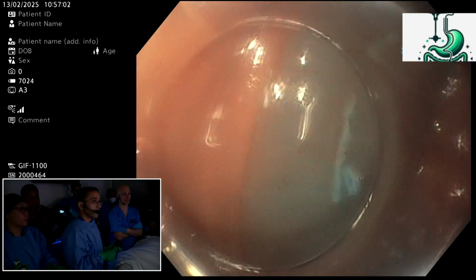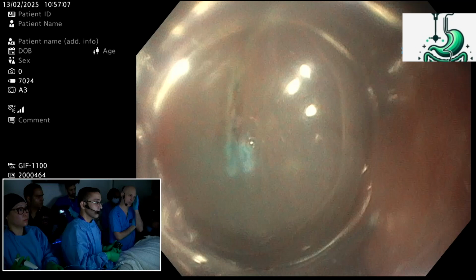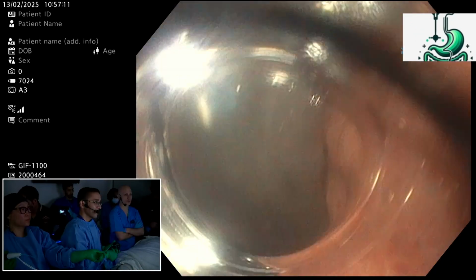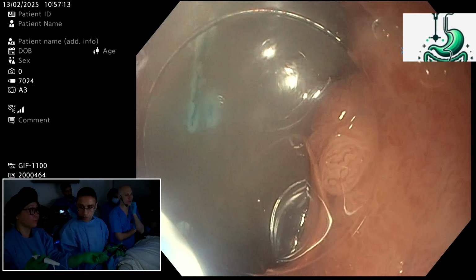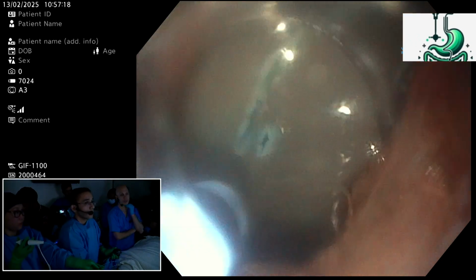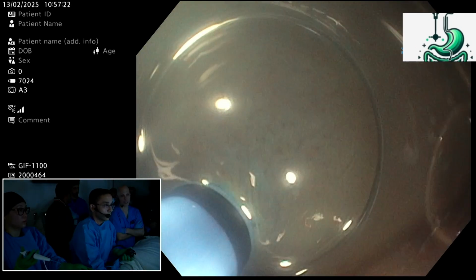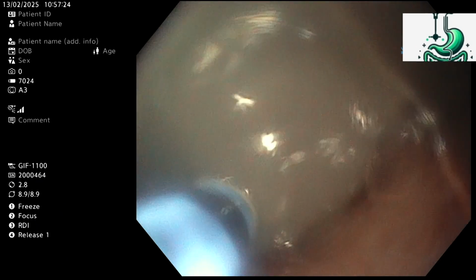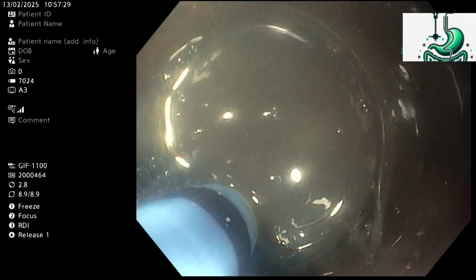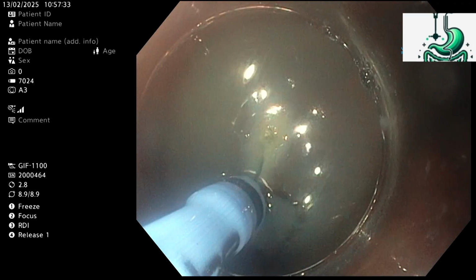Yes, so I usually have a different strategy because I do every procedure under saline immersion. Okay. And I usually use the Flush Knife 1.5, and my settings are Endocut I, and then 1, and then the settings are 1, 1, 4, and I use Swift Coag 3.5. But it depends on the knife, it depends on the technique.